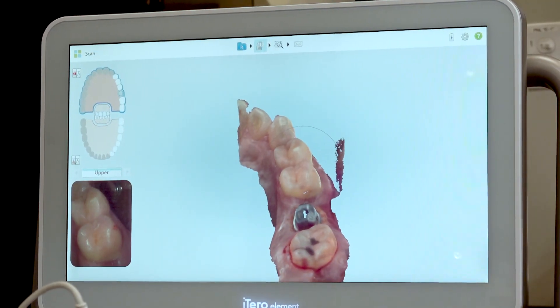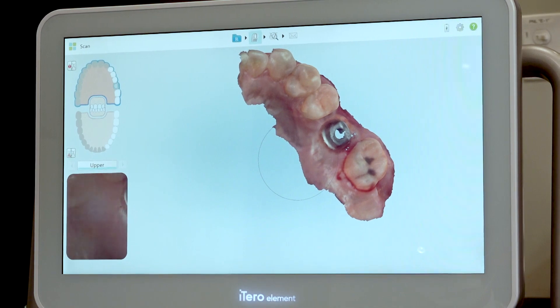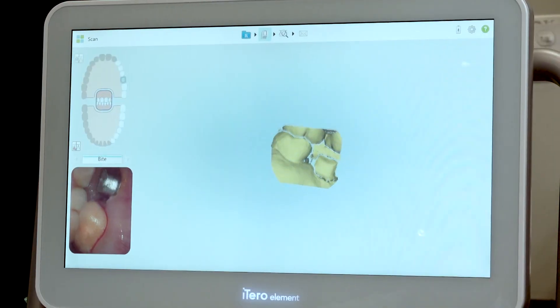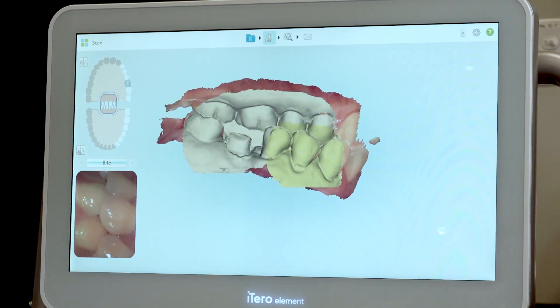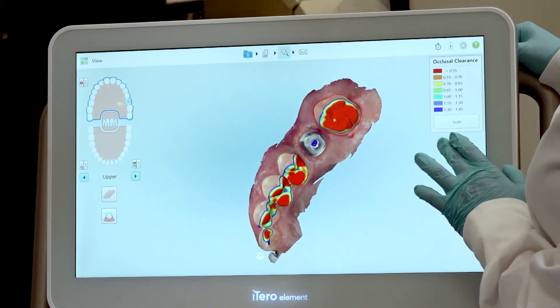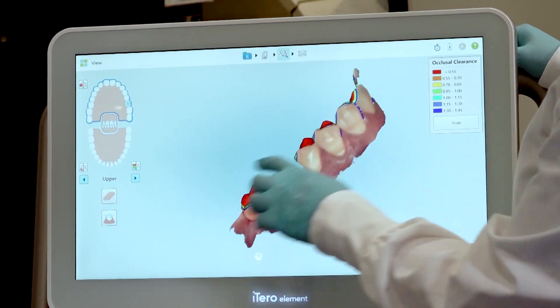When moving too quickly or if the surface is too wet, scanners could freeze or worse create misalignments as it stitches the data incorrectly to build the digital model. This is why after your scan is completed, it's important to take some time to evaluate if the model has generated properly. If what you see on the screen doesn't match the clinical situation, please make corrections as needed or rescan.